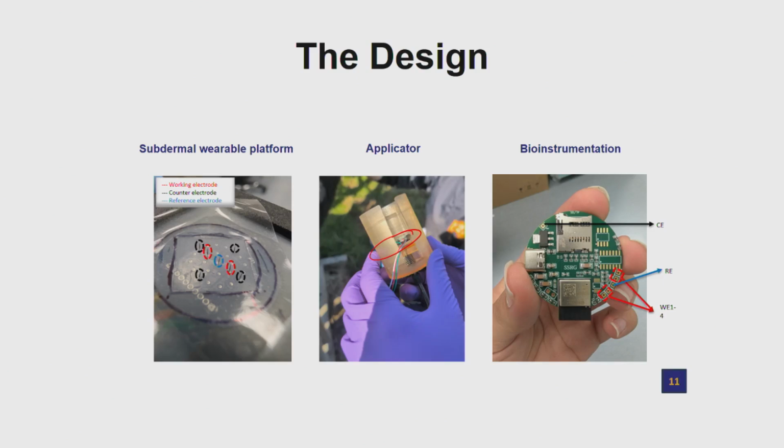You can get designs online on GitHub and similar places, and even programs for 3D printing. So if you have a 3D printer, you can make your own applicator, and you can design the springs. You can adjust it yourself and do some studies yourself. You can order the springs and have a spring-loaded applicator as and when required. Okay. Thank you.